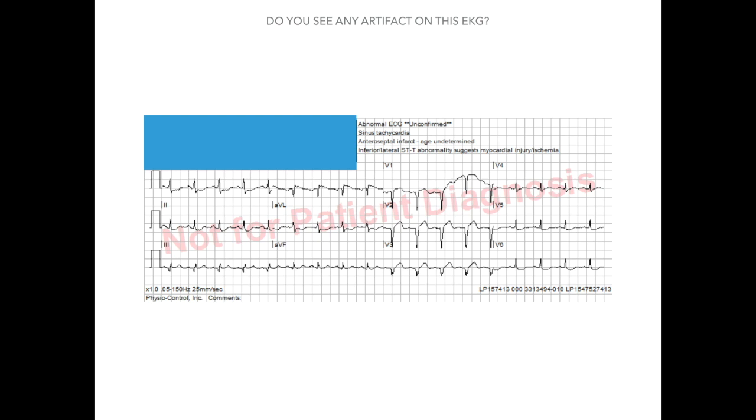And if you're a BLS provider and you're not sure, after you scan each lead, so if you look at lead 1, 2, 3, AVL, AVF, V1, V2, V3, all the way to V6, and you can't confidently say whether or not this is a clean tracing, and whether or not, if the computer gave you the acute MI message, you could say that this message is not likely to be triggered by artifact, then I want you to take extra time and compare the baseline.